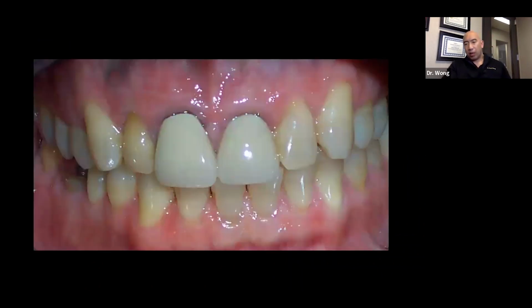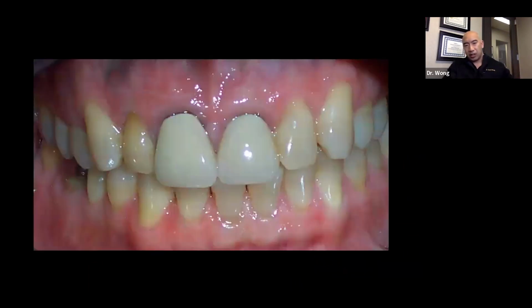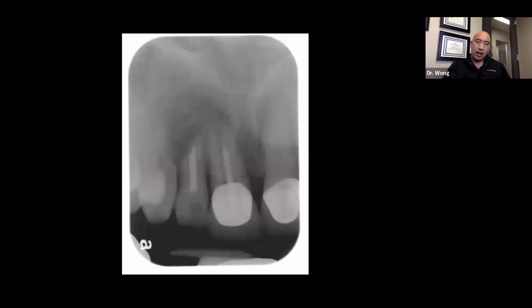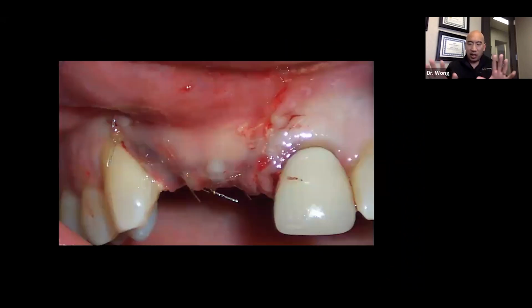So where we're headed now, and what we're about today, is how do we take these types of cases where, if you look above number 7, there's that fistula tract up there, and when you take the teeth out, you can see that we've got blown out facial plates. This is the goal: knowing what to do when we're presented with this type of case, not necessarily being aces at it the first time we try it, or maybe not even the second or third or fourth time we try it, but eventually learning to master this technique, or at least knowing that maybe this isn't for me.